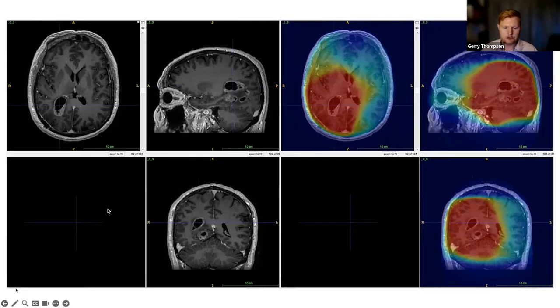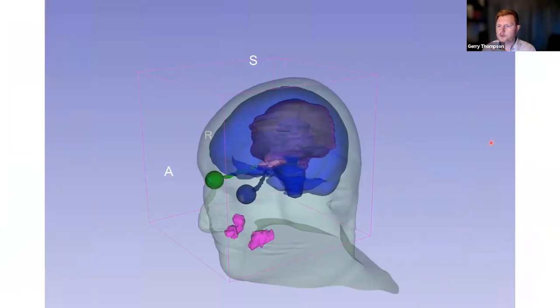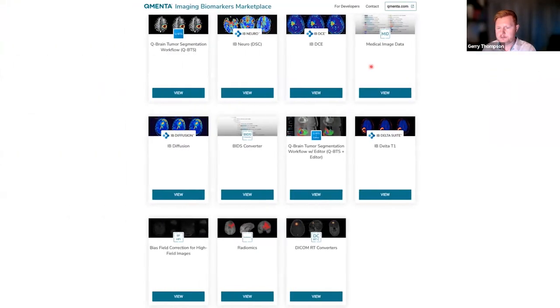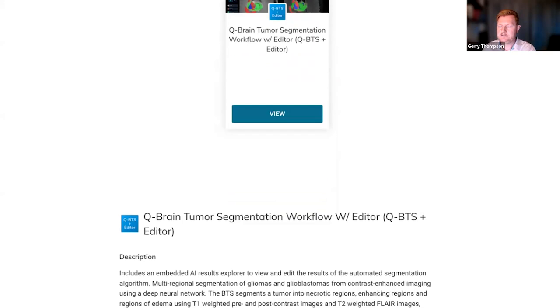And you can see that you've got the dose map here. Also, you have the planning volumes and the organs at risk, and that's all included within that DICOM RT. That allows for assessment if someone wants to determine patterns of recurrence, for example, but also if you have a trial of a radiosensitizing drug. These are the kind of things where you can look at dose distribution in the brain that would not otherwise be possible.